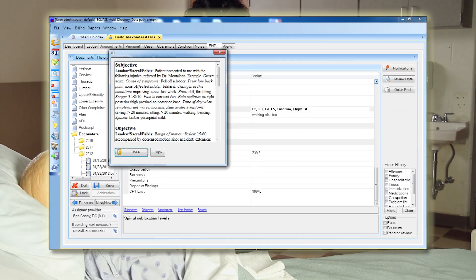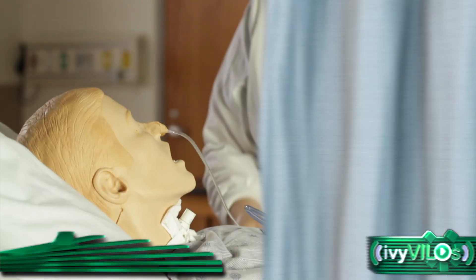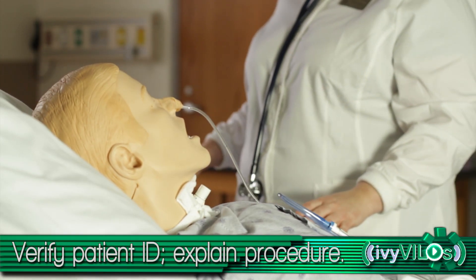Review the physician's order. Perform hand hygiene. Provide privacy. Check the patient's identification band. Ask for their name and birth date. Explain the procedure.